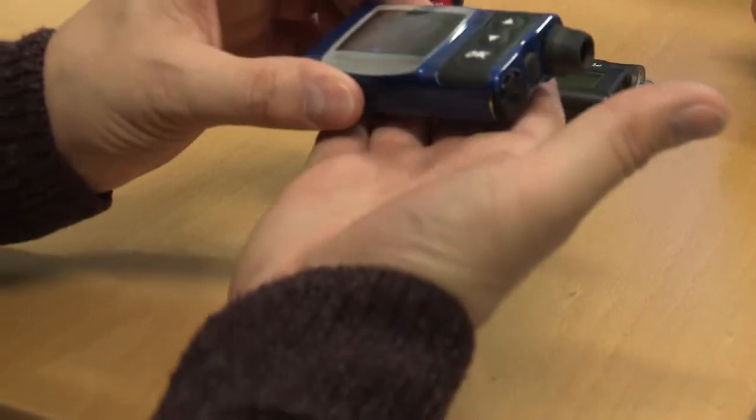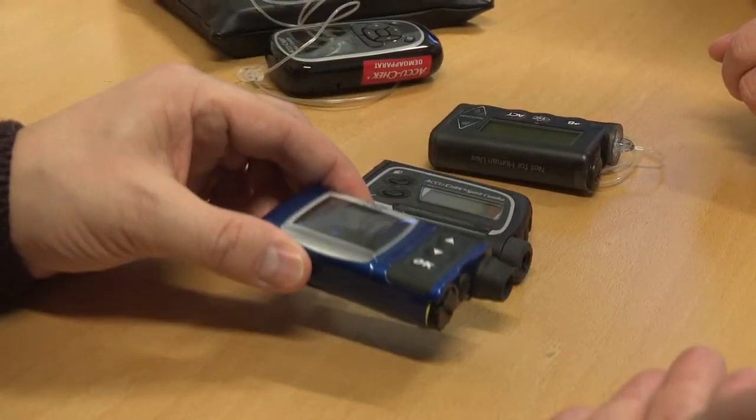And do the patients wear them every day? Yeah, they have to wear them all the time. Of course, they can take them off, but then they have to set insulin with pens because there is just short-acting insulin, and 1 or 2 hours without the pump you can get a very high blood sugar, at least after 3 or 4 hours.